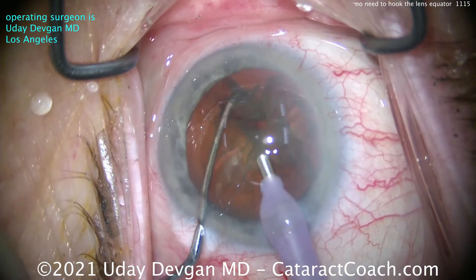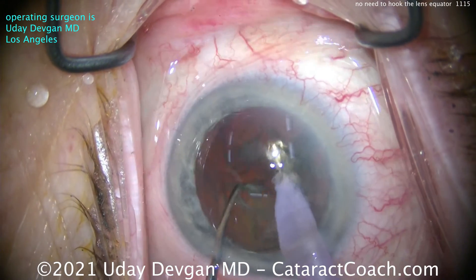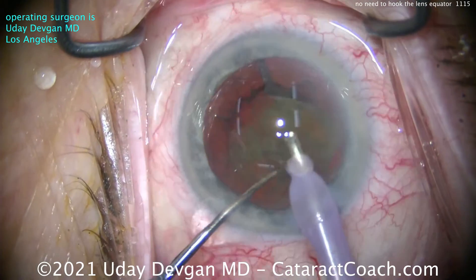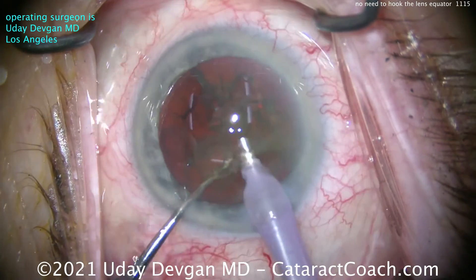A nice chop is achieved. Two halves are created. Now rotate the nucleus and do it again — chopper goes into the nucleus and just separate them out. Traditional horizontal chop requires you to place the chopper under the capsulorrhexis and go out to the equator of the capsule or bag so you can hook the lens equator.